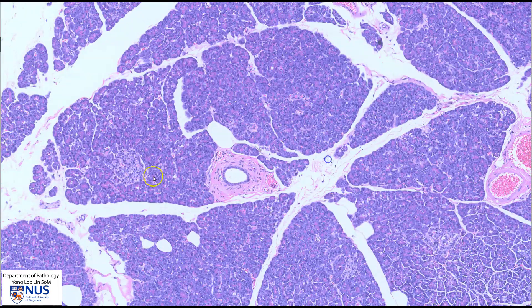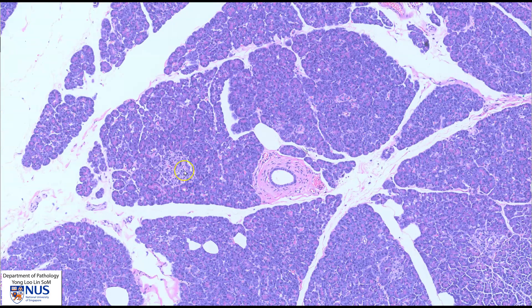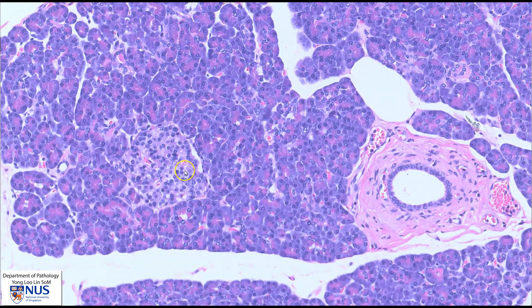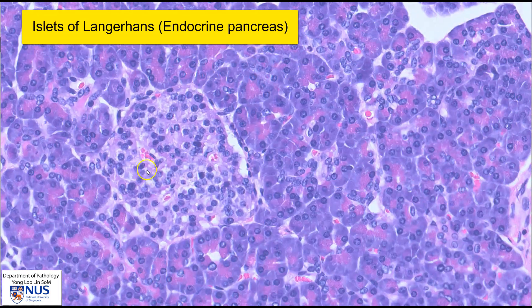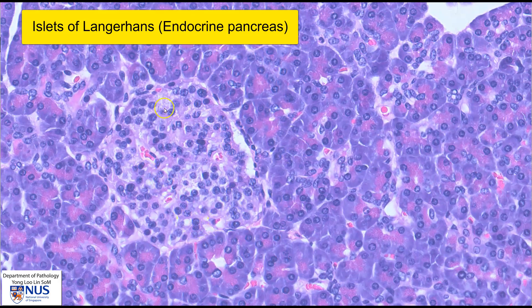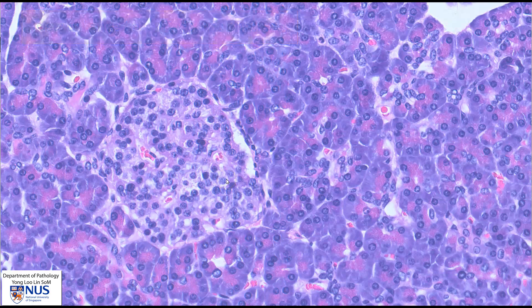We can also see some of these paler nests or islands of cells, and these are the islets of Langerhans, which form the endocrine component of the pancreas.